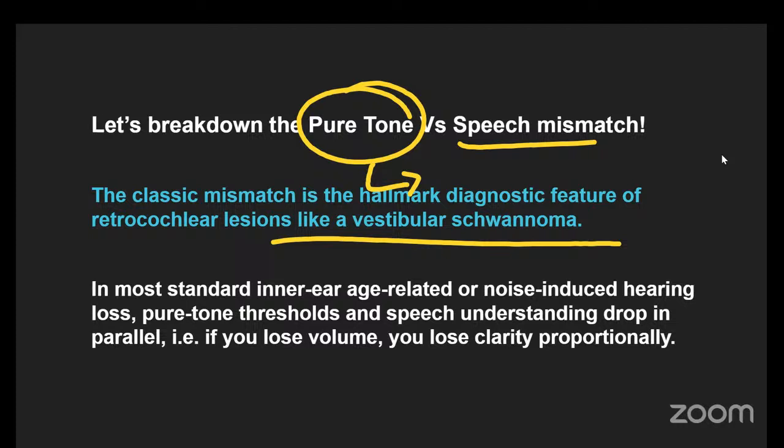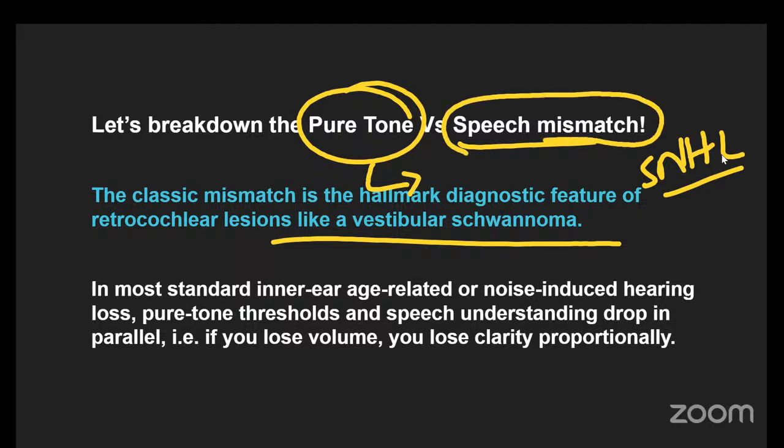What the sensorineural hearing loss is going to do, let me write, the tone is going to be preserved. Patient will be able to pick up the beeps. The problem will be in the speech discrimination. They will have a hard time in recognizing or separating the words. Am I making sense?